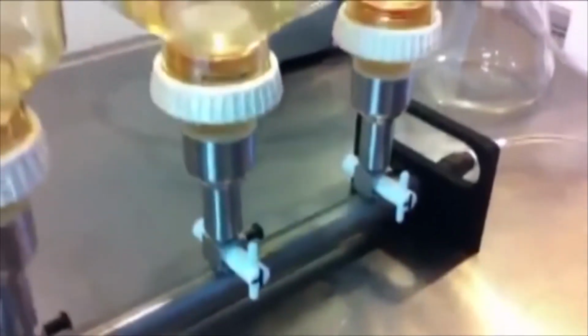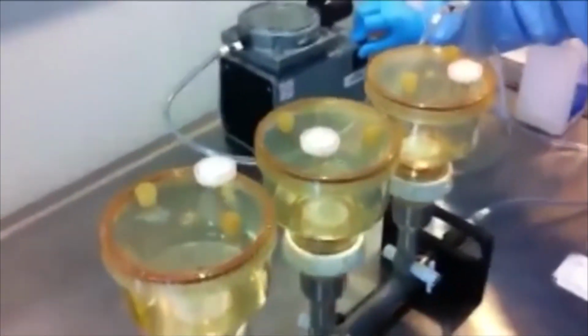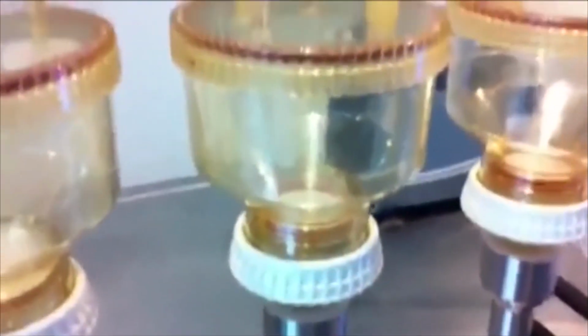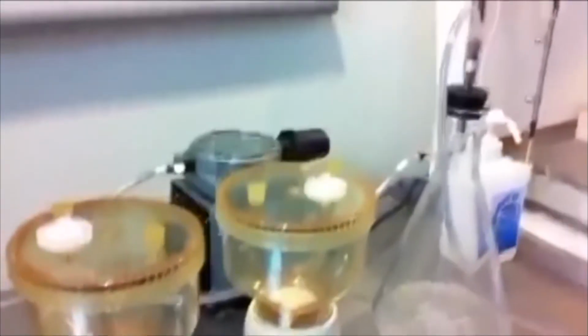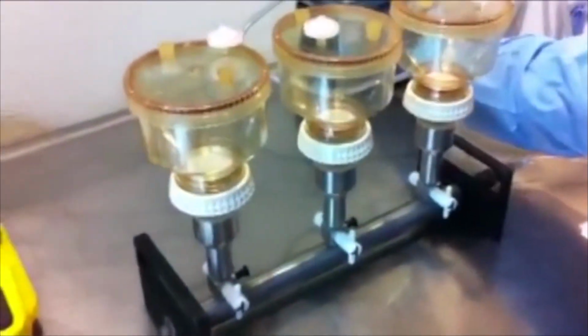Now, the next step is to check to make sure the valves down here are in the right position. And they look good? Okay, and then we're going to turn on the pump. And how long does this take? It doesn't take that long. Within seconds. So you can see it's being pulled through here, through the manifold, and into the receptacle. And they are just about done. Okay, so that's done. Now we can take the filters off, and we are going to put them into a Petri dish. At this point, we want to add 2 mL of the solution that we're testing.